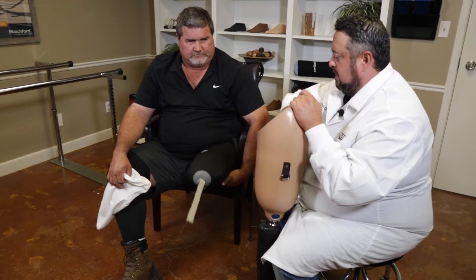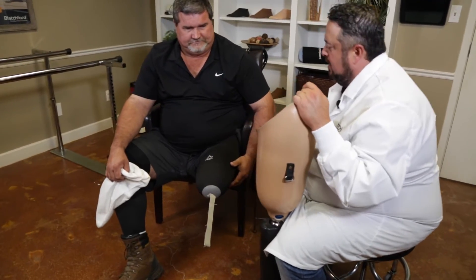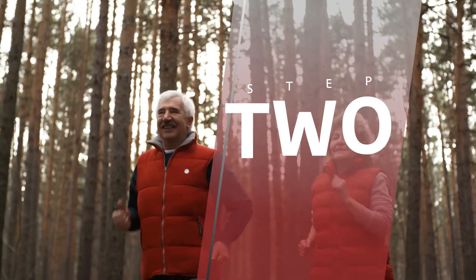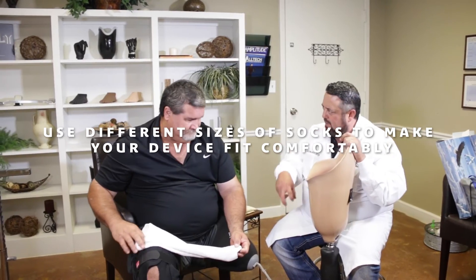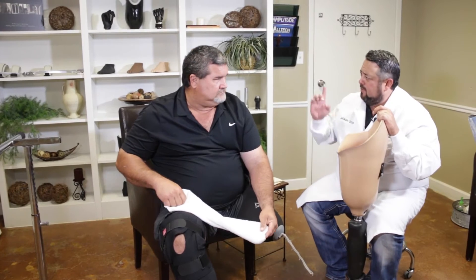The way that we take up the room inside of the socket is called sock management — we use these different plies of sock. The socks take up the space so we don't get rubbing in the wrong places. Once we get moving around inside the socket too much, we've got to add socks. You'll start going up and down, start feeling a lot of pressure in the adductor area, feel a lot of pressure in your rear and right on the bottom of the bone.